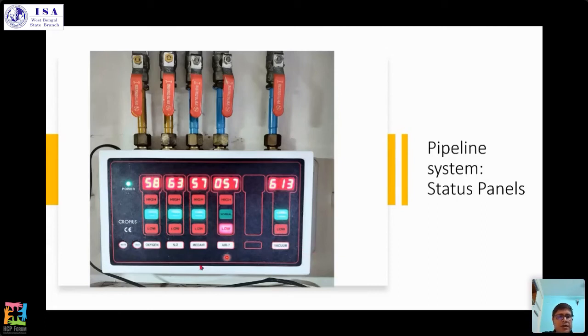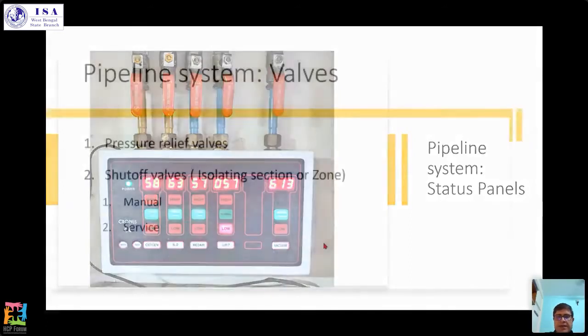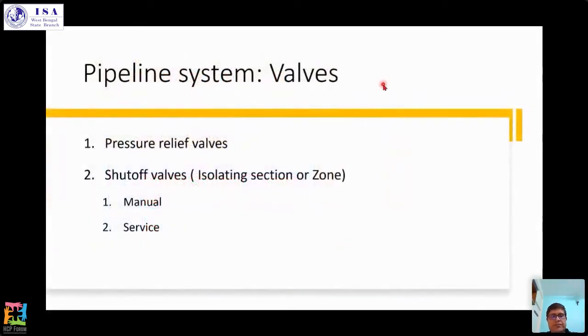So, this is an audio-visual alarm. There is a test button, which is used to test the system, and there should be a regular maintenance schedule where someone presses this test button and tests that this is working properly. So this is an area alarm system or monitoring system with an alarm panel.